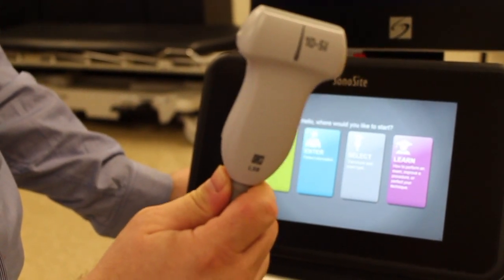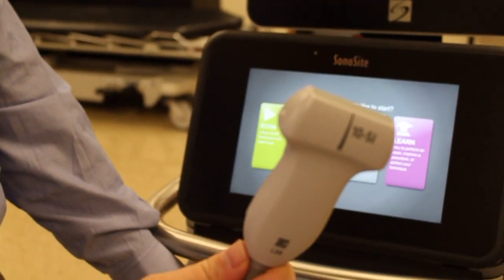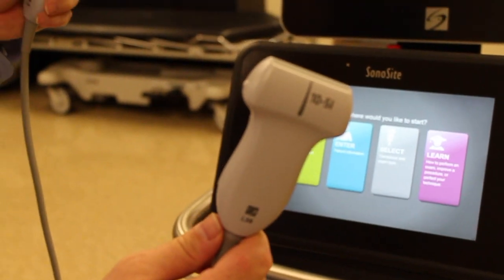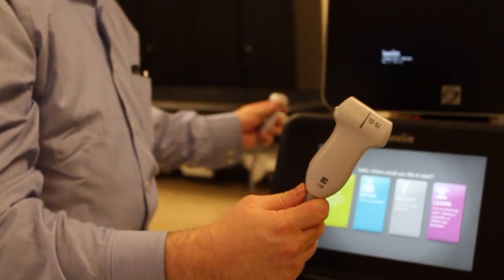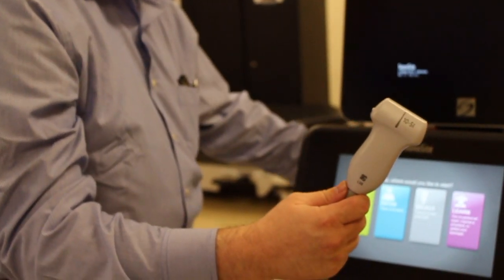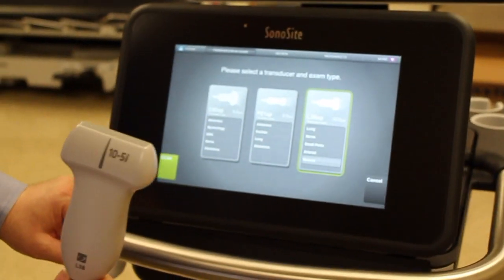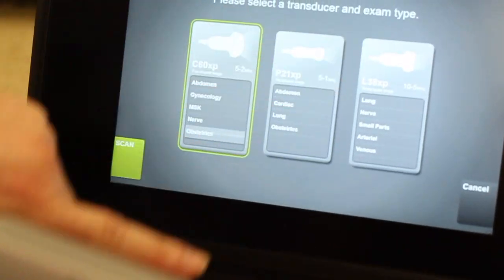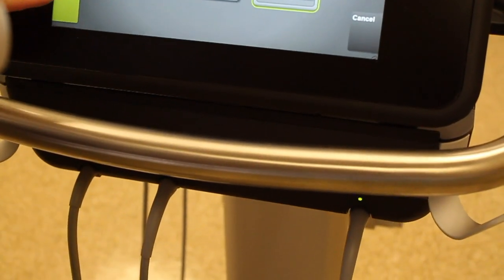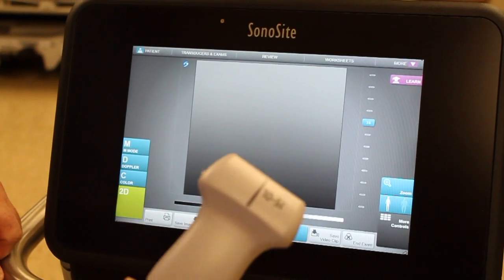This 5 to 10 megahertz linear probe is going to be the probe that you use nearly all of the time. If when you came in and turned it on there was a green light over one of the others — either your curvilinear probe or the smaller probe we use for cardiac exams — if it was preselected to one of those, you would go under Select and then change your probe. The green lights down below will change as you select it, and once you've done that you can press Scan.